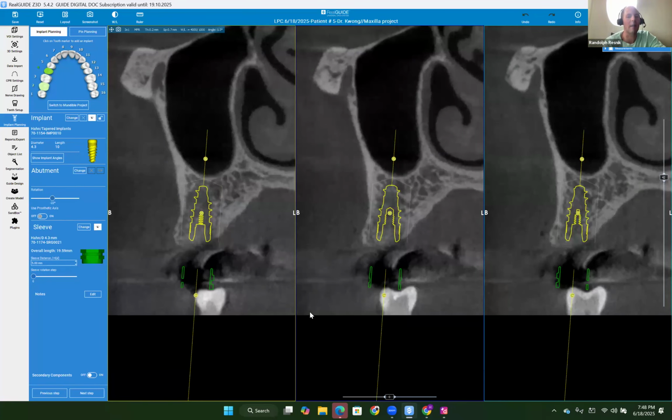Affirmative, Doc. Yeah, it's just at the apex there. You're going to have a little difficulty with that soft tissue down there. So you will be able to get rid of the majority of it with a burr. It's just not going to be the best bone quality there. So under-prep it by one or two drills when placing that.